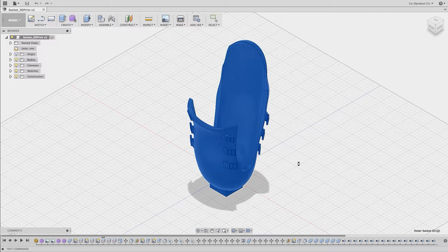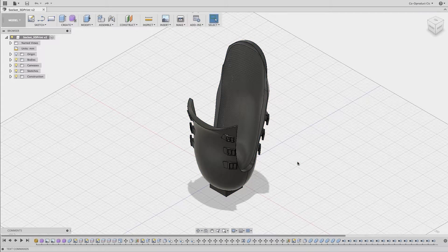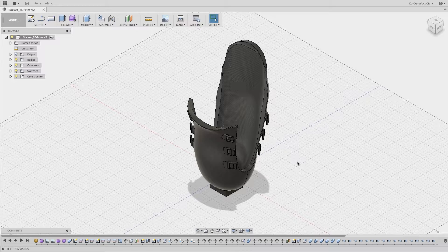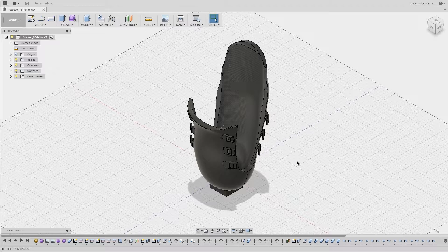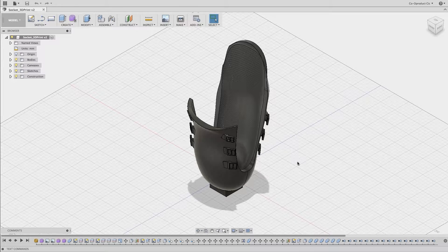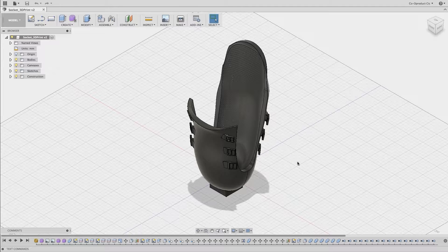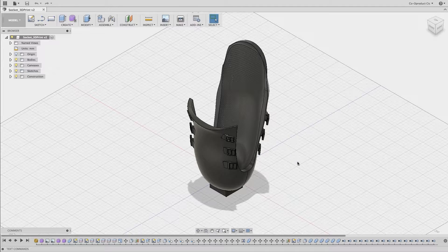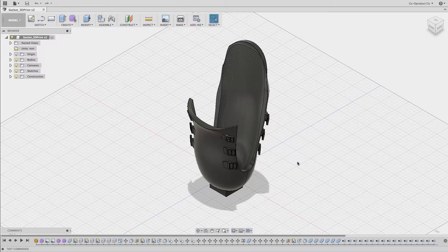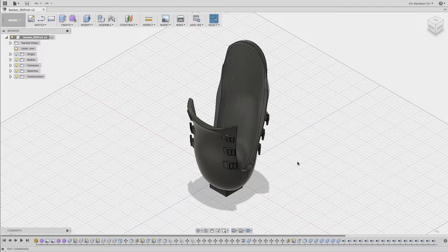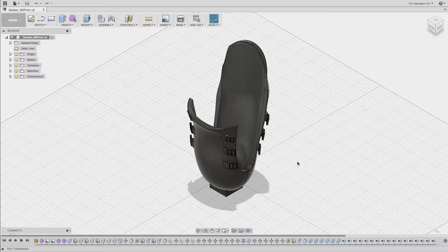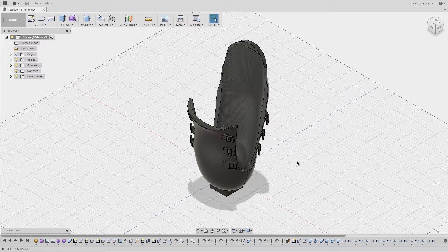And that's the STL file generated for 3D printing. Now all you need to do is open that file in your 3D printing slicer software. And this is all we need to do to create a 1 to 1 scale STL file for 3D printing in Fusion 360.